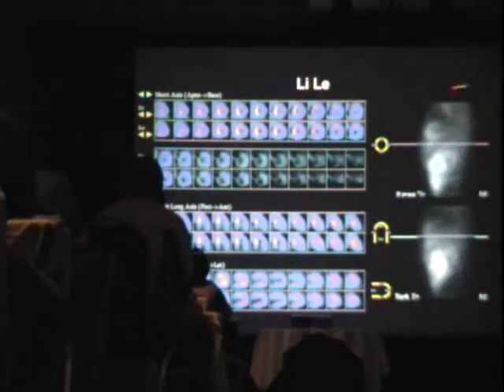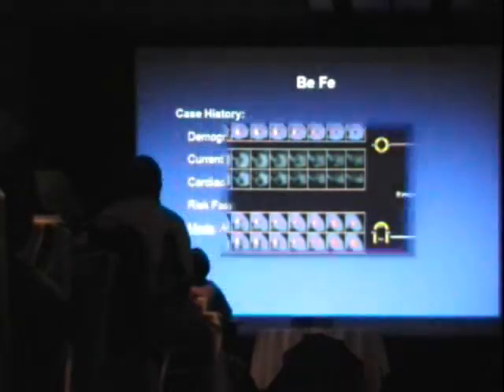One particular aspect of this cardiac motion is that you see that the septum doesn't move all that much. It's all the work provided by the lateral wall. This is what we call paradoxical septal motion, and it is typical for patients who had prior open heart surgery. Because of the pericardium being open, you have a different pattern of synchrony. Sometimes it looks like a left bundle. But the point here is that when you re-image the patient with the arms up, the defect is still there, and you can still see evidence of ischemia in the lateral wall.